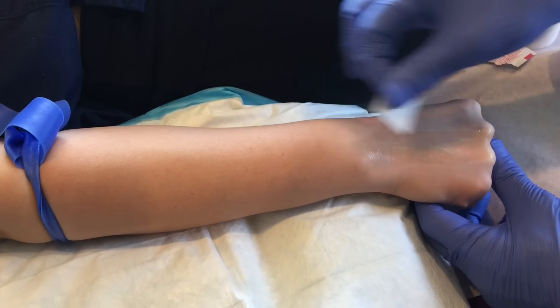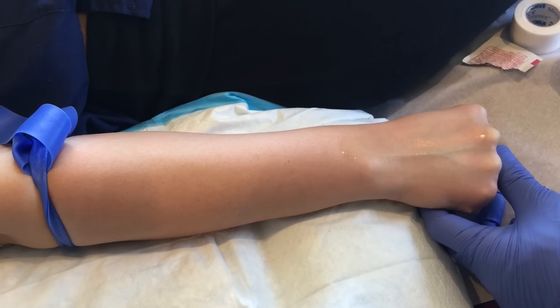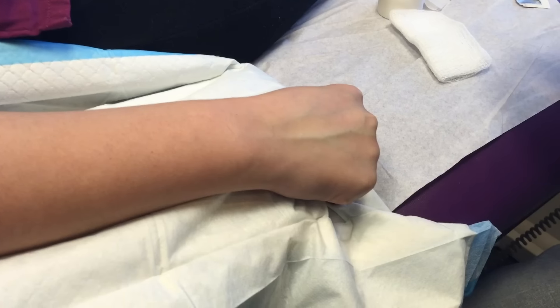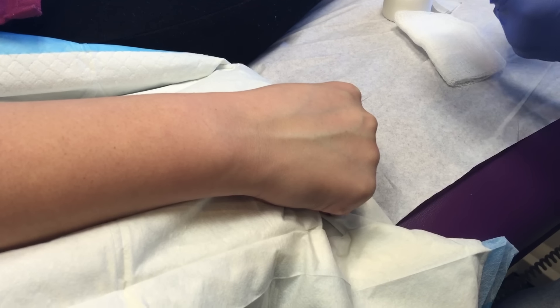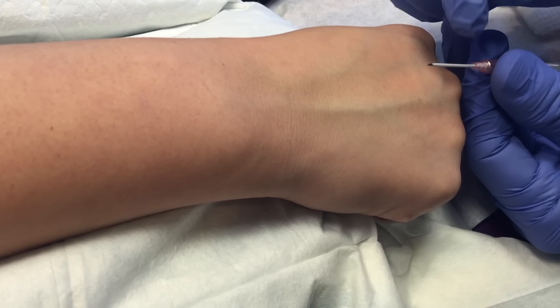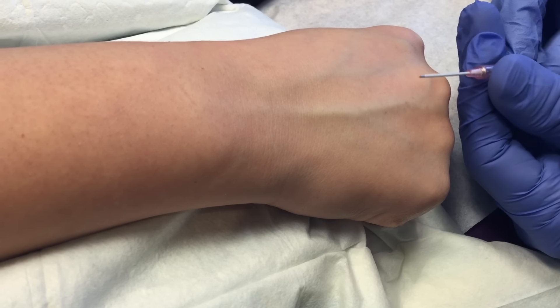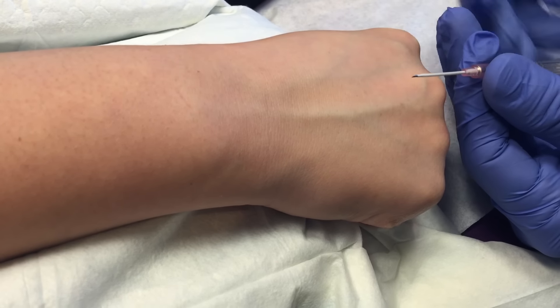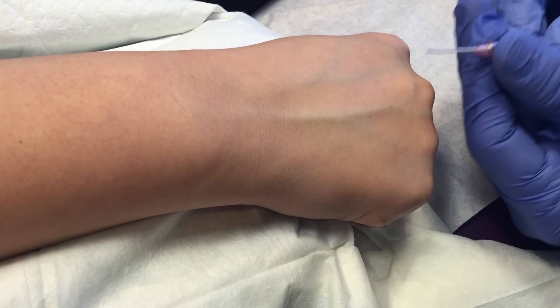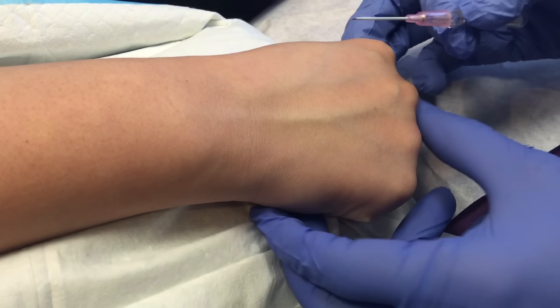I'm going to wipe the area with some alcohol. Now, first you can see that the plastic part of the catheter is shorter than the needle, and you have to get all of that portion in before you start trying to advance. The second thing is I always have it bevel up.